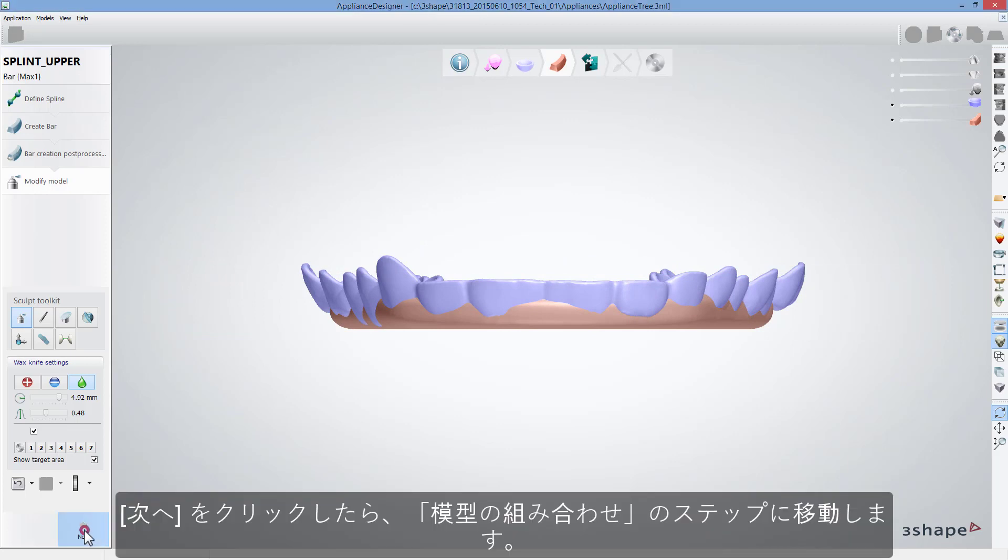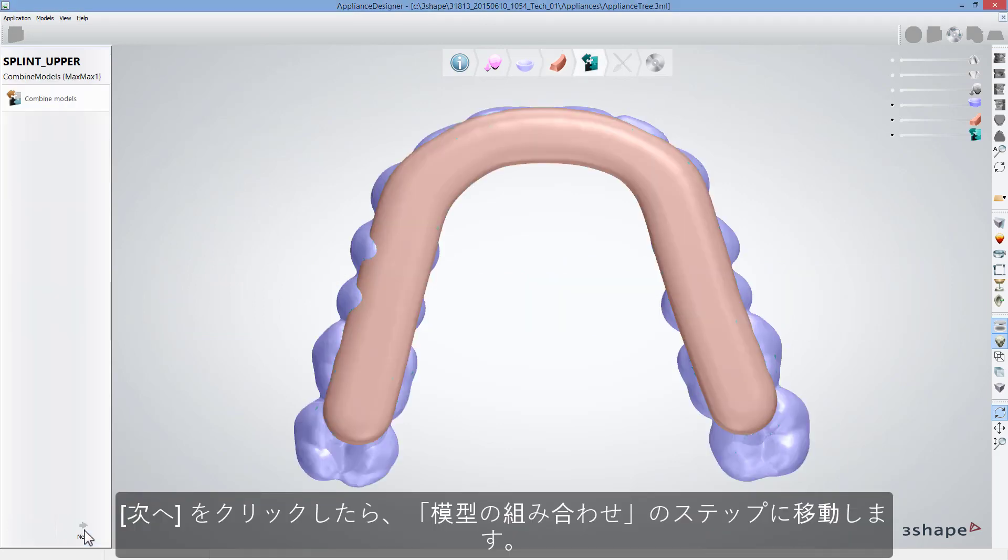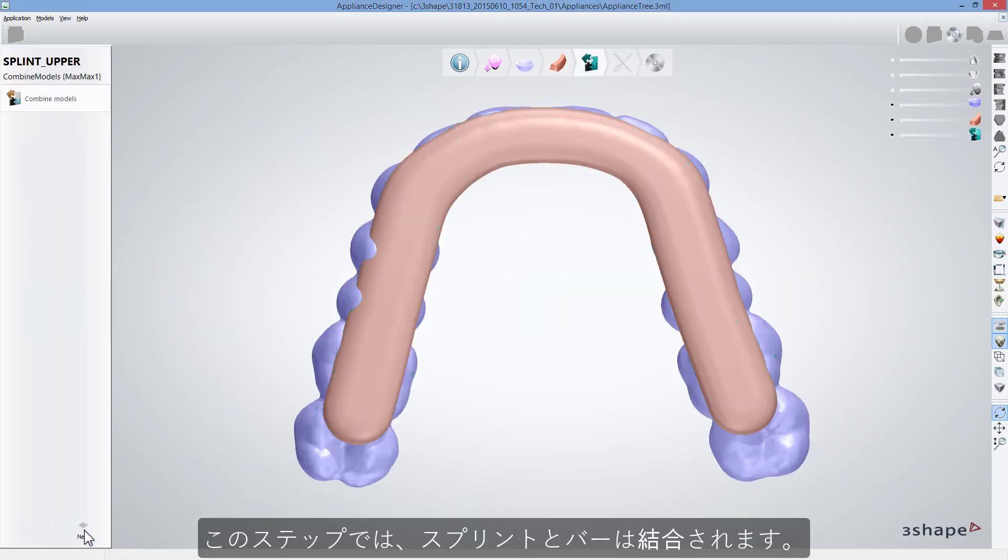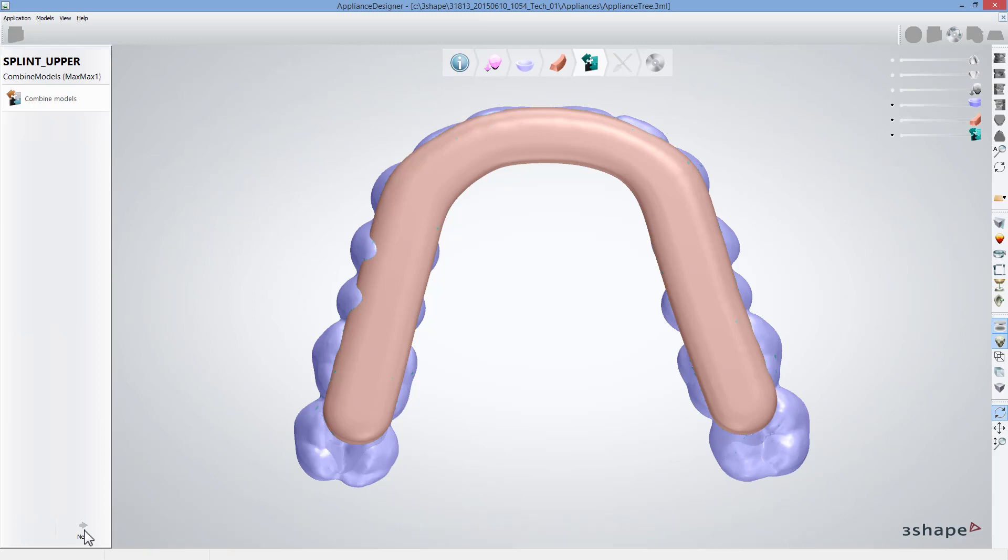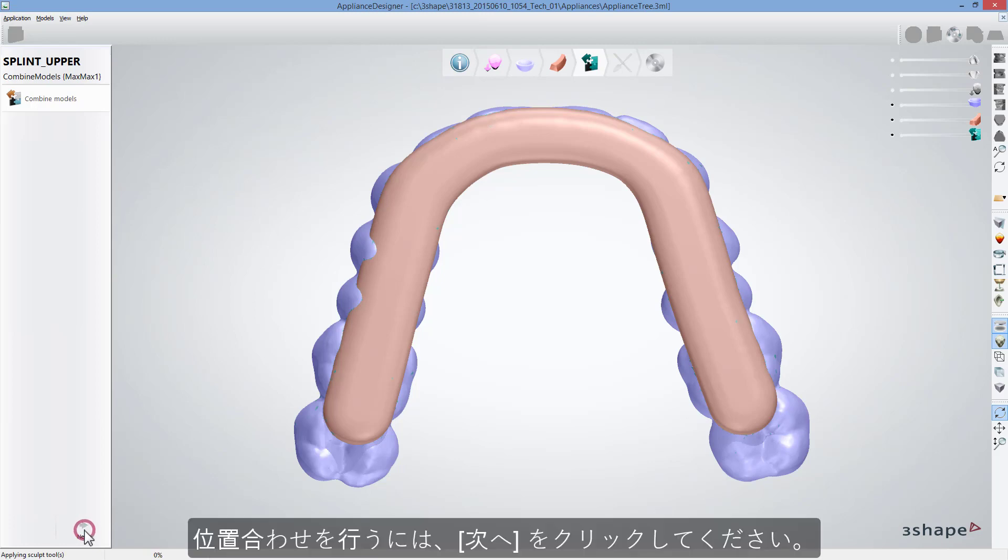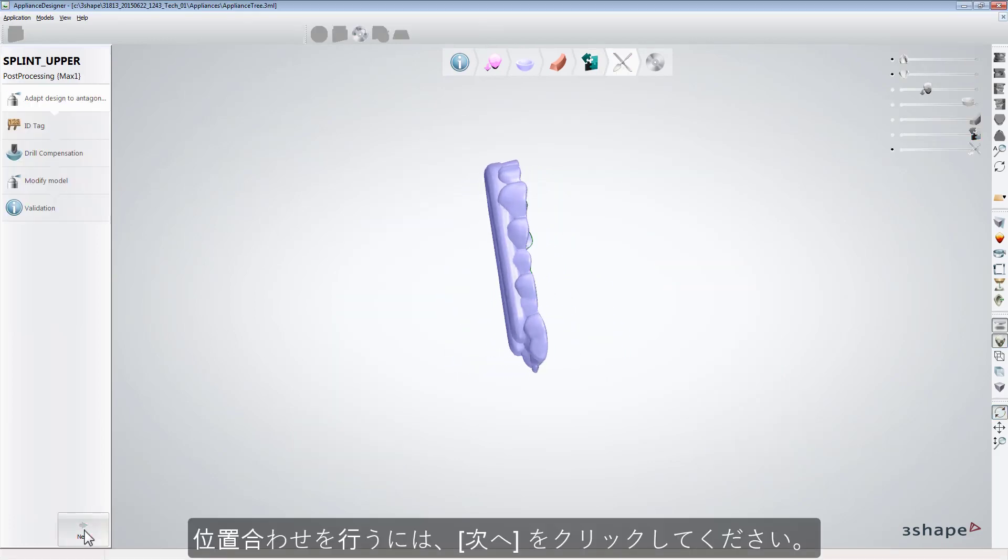When you click Next, you will get to the Combine Models step, where the bar and the splint will be merged together. Click Next to combine them.